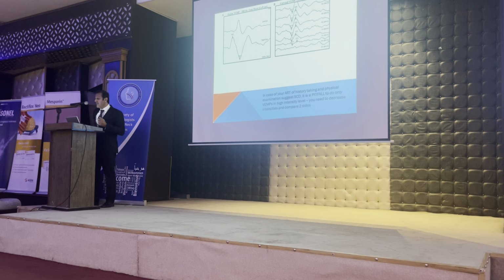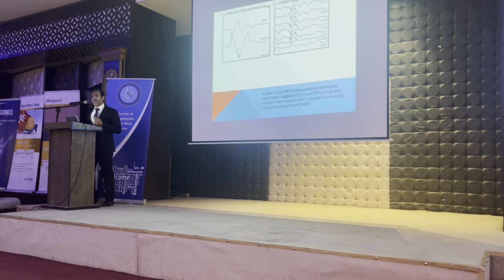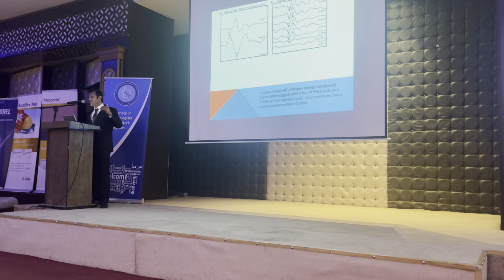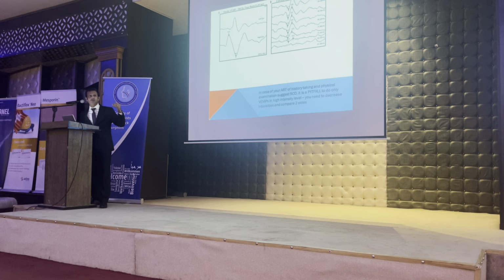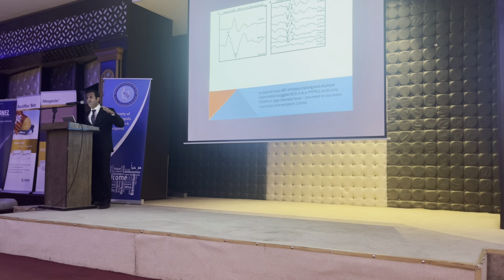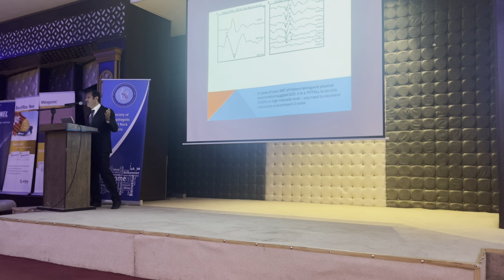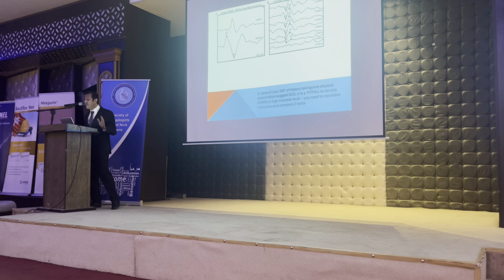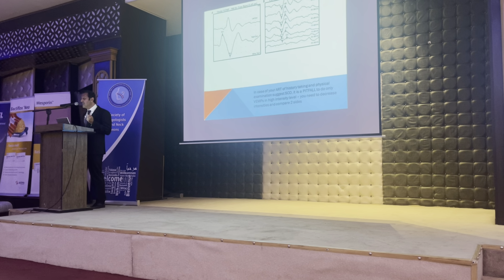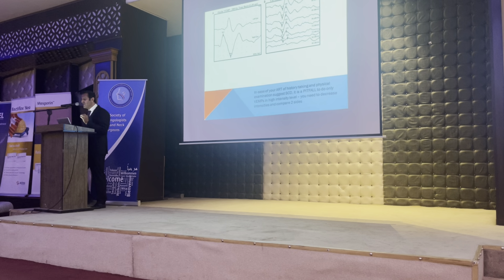In case of superior canal dehiscence, a third window pathology, you can identify the waves at a lower intensity level, because usually, as Dr. Muhammad says, VEMPs are recorded at very high intensity, around 95 to 100 decibel. If you can get it at, for example, 65 or 60 decibel, this is diagnostic of superior canal dehiscence. So if your history taking and physical examination suggest superior canal dehiscence, it is a pitfall to do VEMPs at high intensity level only. You need to decrease the intensity level of your device. So there is a pitfall.